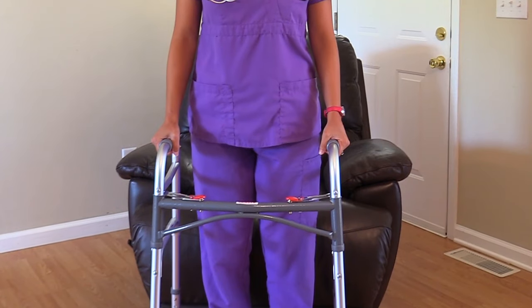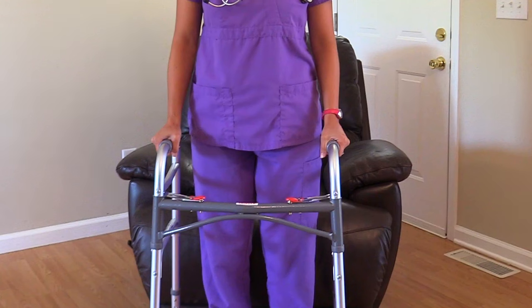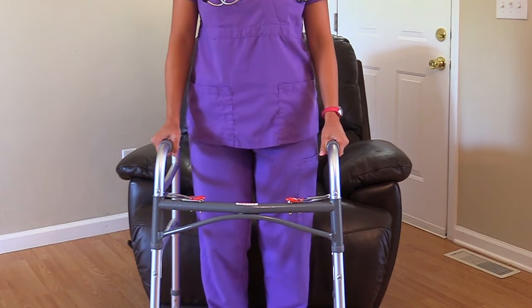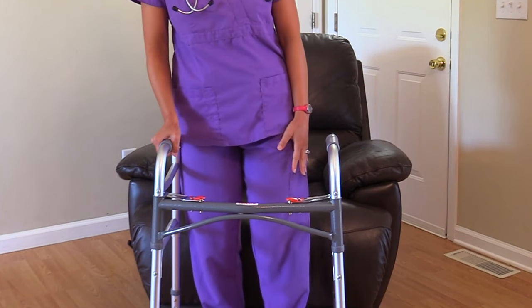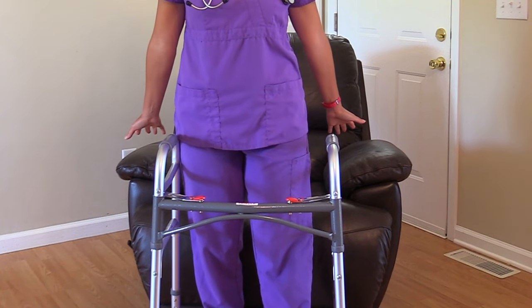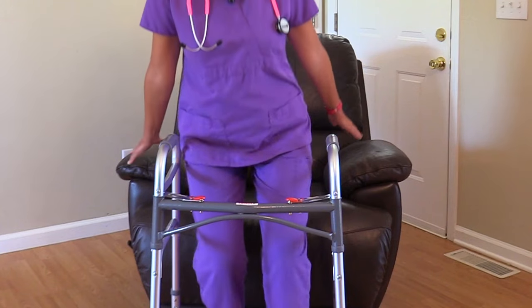To sit down in a chair, the patient is going to take their walker, hold on to the hand grips, and slowly back up to the chair until they feel the chair with the back of their legs. Then they're going to slightly extend the weak leg out, take their hands and position them behind them on the armrest, bend their strong leg, feel for the chair's armrest, and then sit down.